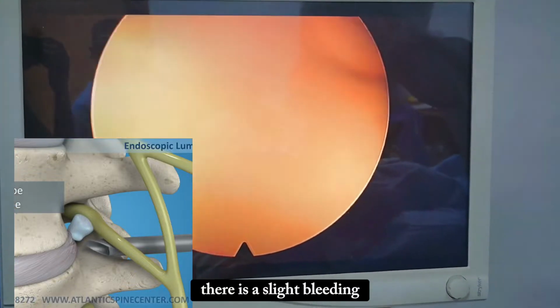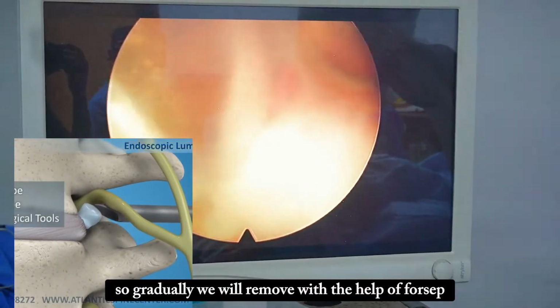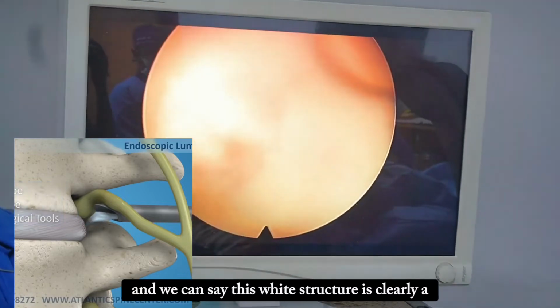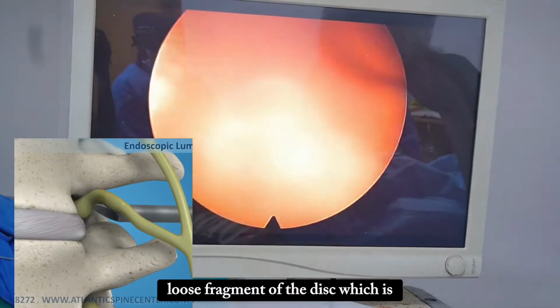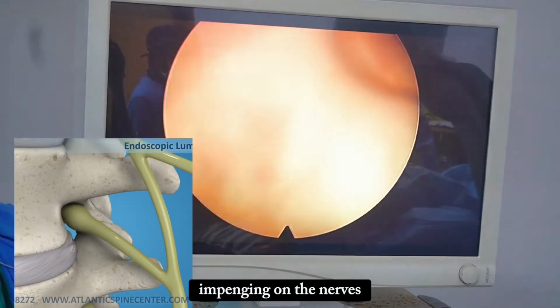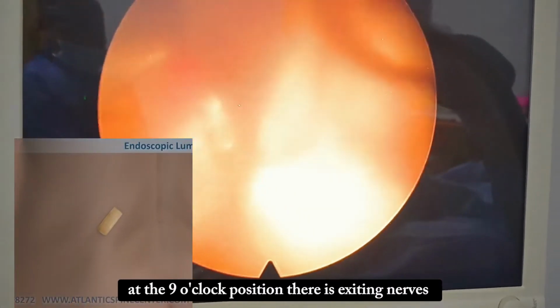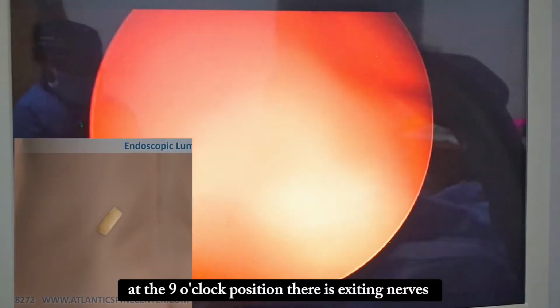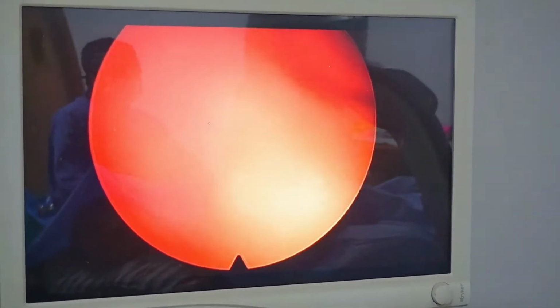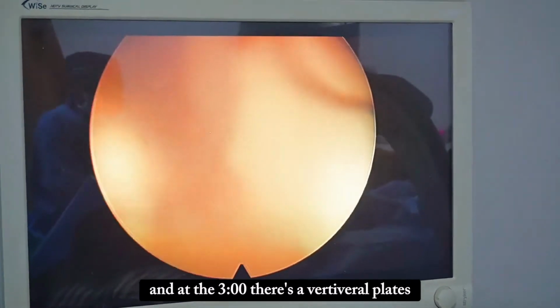There is slight bleeding, and this white structure is the prolapsed disc. So gradually we will remove it with the help of forceps, and we can say this white structure is clearly a loose fragment of the disc which is impinging on the nerves. At the 12 o'clock position there is the thecal sac. At the 9 o'clock position there is the exiting nerve, at the 6 o'clock there is the disc, and at the 3 o'clock there is the vertebral plate.